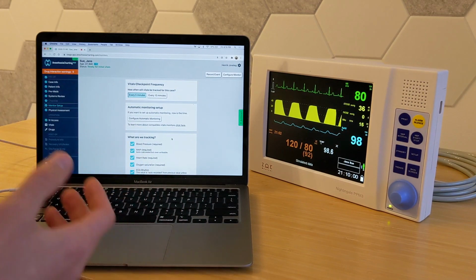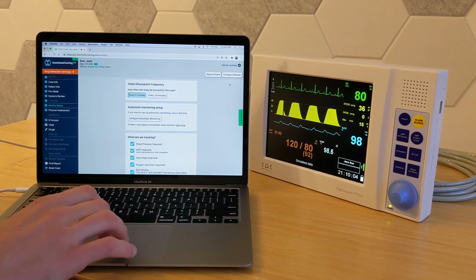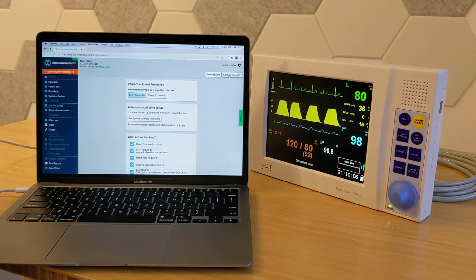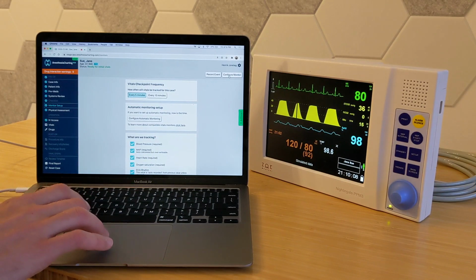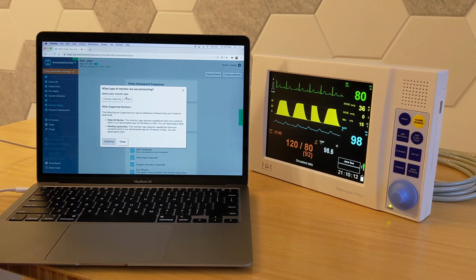And what I've done here is I've started the case, and anytime you've started the case, there's a button that appears in the upper right here that says Configure Monitor, and that's what we're looking for. So I'm going to click that, and then now I get the option of what kind of monitor I'd like to connect. So I'm going to go ahead and actually use the cable.